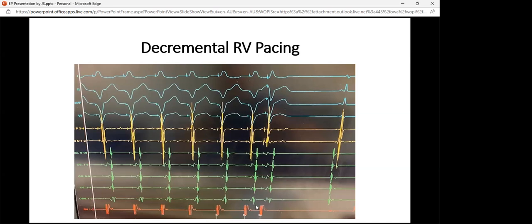So we've determined we have VA conduction. And the next bit we want to determine is, do we have VA decrementation? So is that signal from the ventricle to the atrium delaying? If it does, then we think it's nodal. If it doesn't delay, then we think that this is perhaps going through the pathway. And it's hard to represent here, but I can promise you that this VA time did not decrement. So in my mind, I was starting to think, wow, perhaps we have a pathway here.